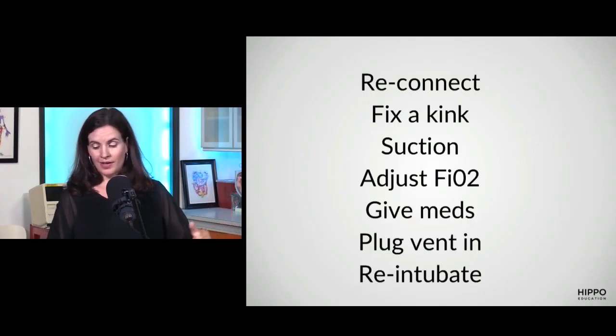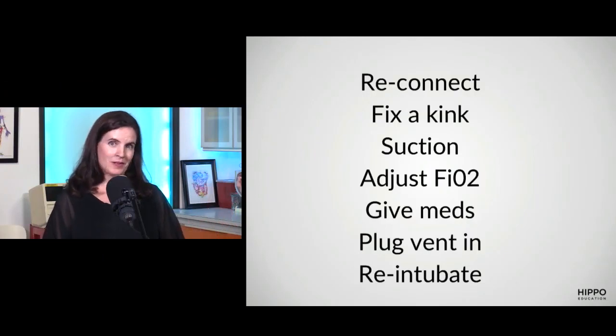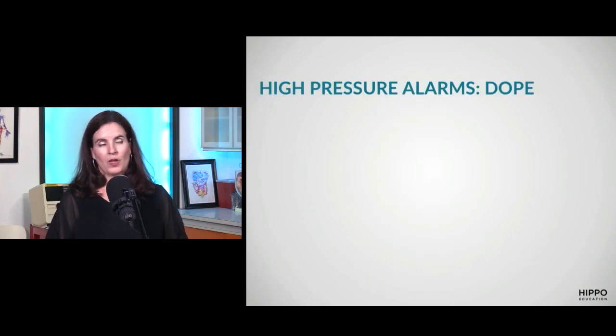All right. For all of the keeners out there, if you want to take this to the next level, step 5 is for you, where we start giving you an approach to the actual alarms. I'm just going to run you through our 2 most common alarms. High pressure is an extremely frequent alarm in the emergency department, and I use the mnemonic DOPE to run through an algorithm for this.